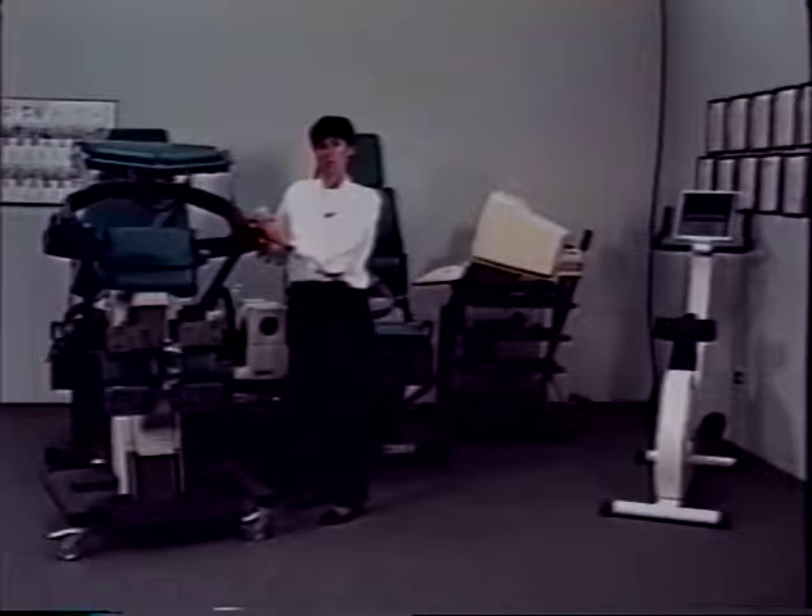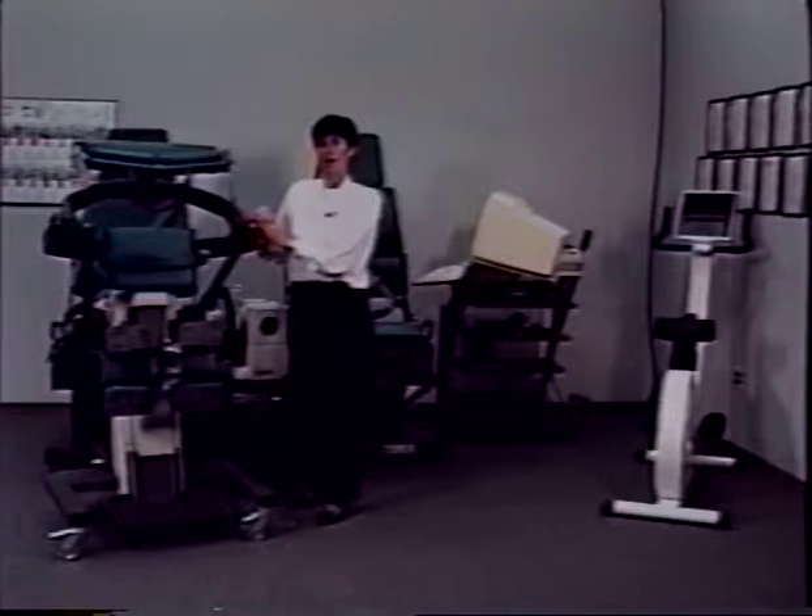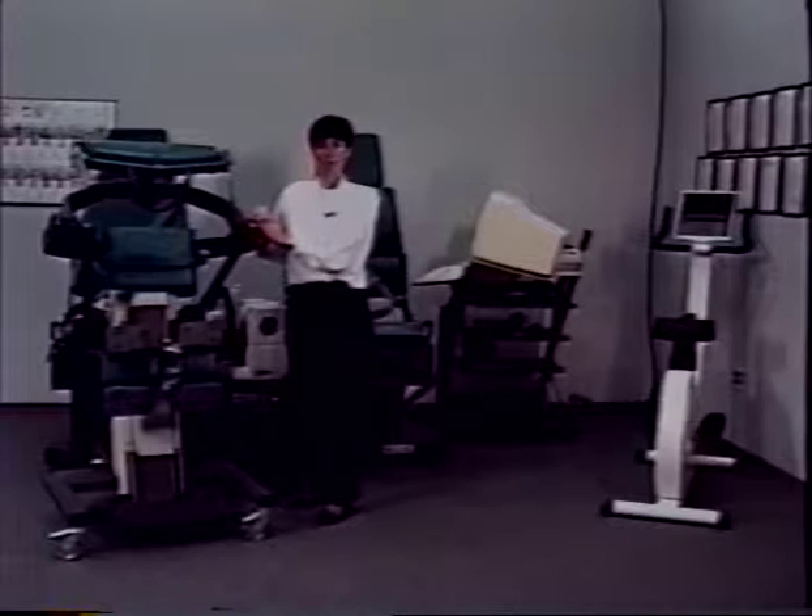Also, standing reduces the intradiscal pressure associated with sitting. The TEF modular component utilizes the same software as the Cybex 6000, so there is nothing new for the clinician to learn. It requires no additional operating space when used with a fully configured Cybex 6000.